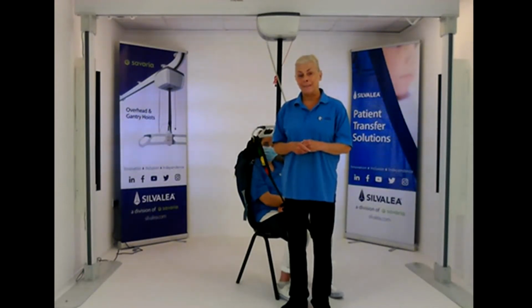The next question is, sorry, Rebecca, I did miss your question. Would this help for someone with fixed scoliosis whose upper body tends to slip out of other in situ slings? Quite possibly, yes, because of the stretch.